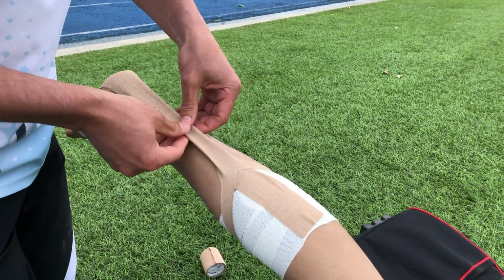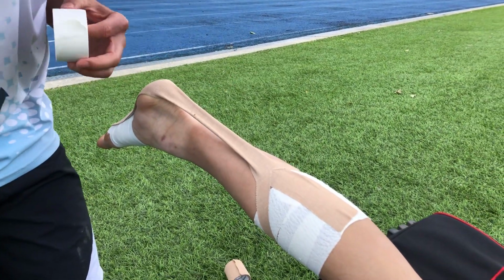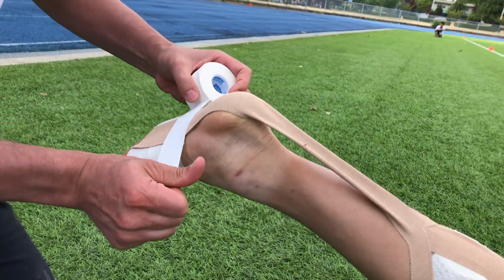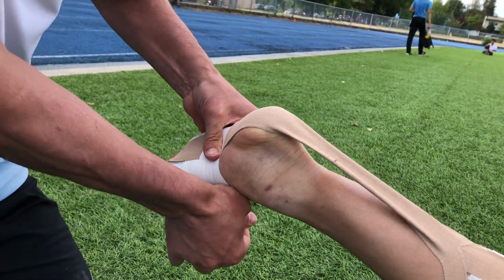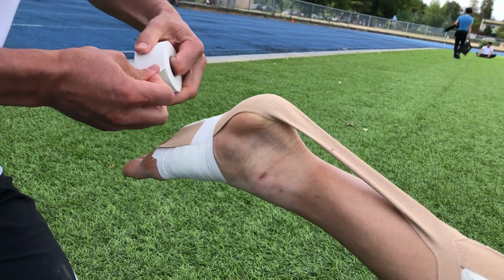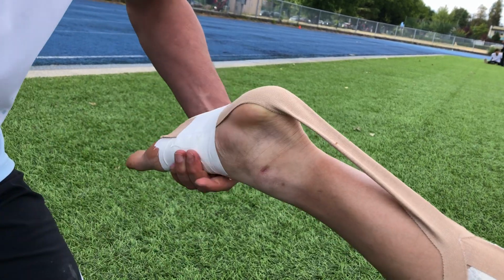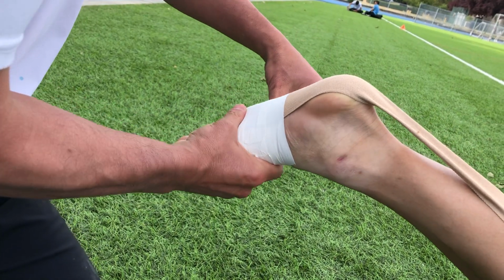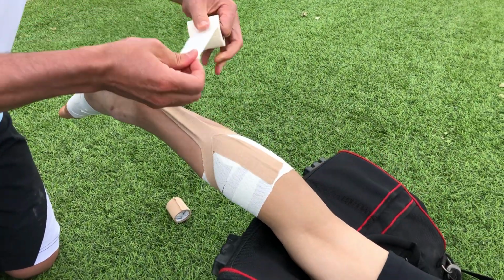Now we can complete that folding. Be careful not to move still, because this is not anchored on either end. We want to get this down quickly before it might pull off of the foot. It's good. And then we can just close that up on the top.